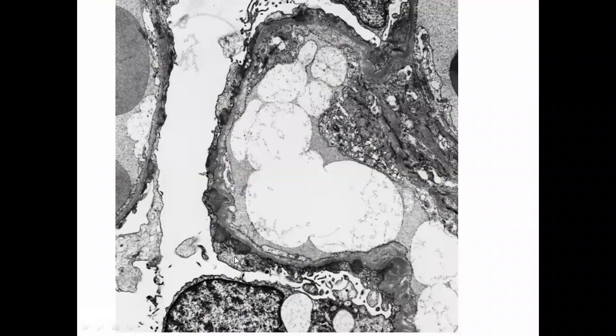Since they are lying just beneath the podocyte, the other name for podocyte is a visceral epithelial cell. This is a podocyte nucleus, a big nucleus, and this is the podocyte cytoplasm. You can see these deposits: 1, 2, 3, 4, 5, similarly 6, 7. So there are subepithelial immune complex deposits.